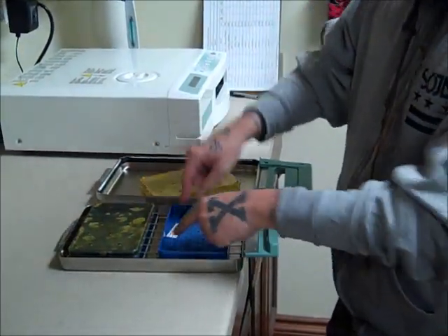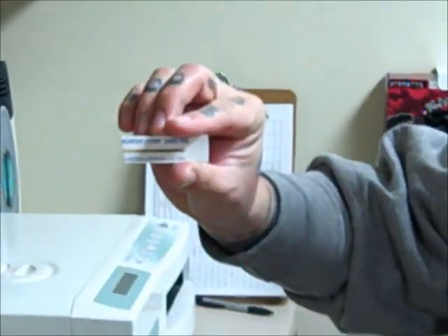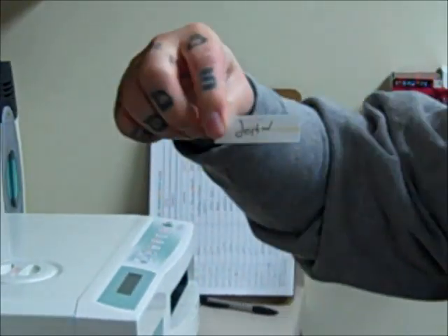Once we open up the cartridge, we can take a look at the strip and we can see that it's now gone from yellow to brown, and it has my name on it.